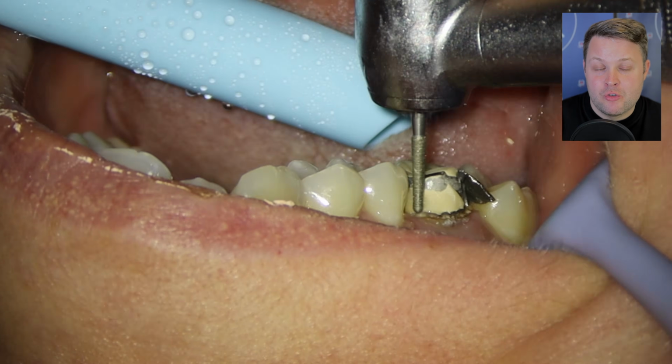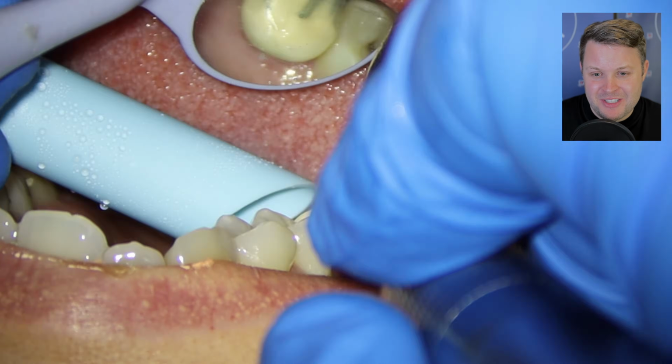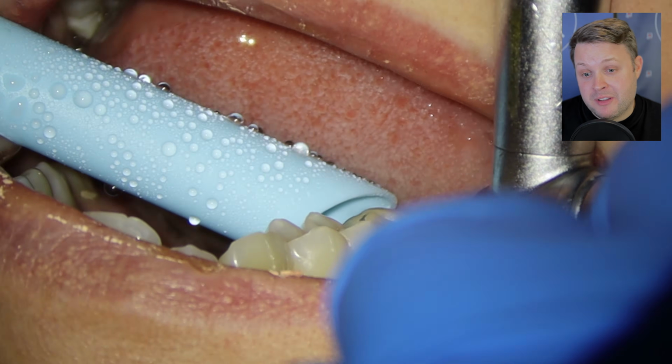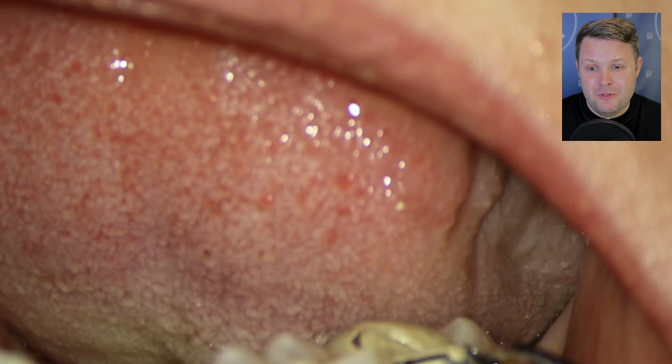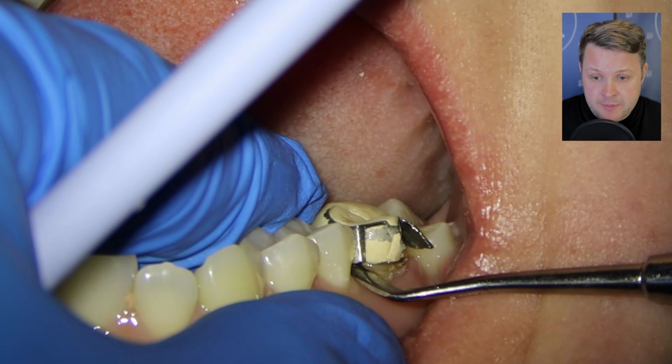This can be quite traumatic sometimes to the wrong patients, so you just have to be super, super careful. And obviously you need to be mindful if that crown pops off. Someone needs to be there with the suction to get it, so it doesn't fall down the back of the patient's throat, because remember, you've not got rubber dam on the tooth.